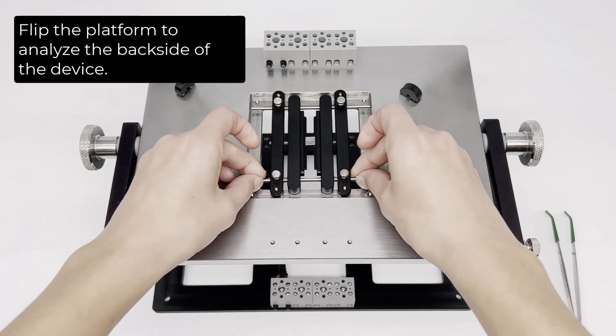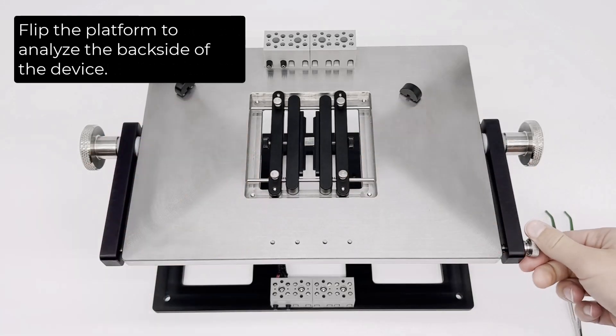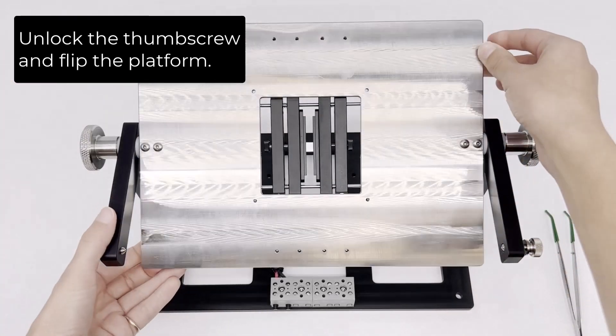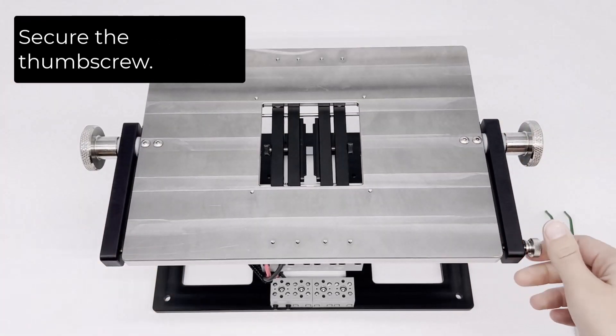Flip the platform to analyze the backside. Unlock the thumb screw and flip the platform. Secure the thumb screw.